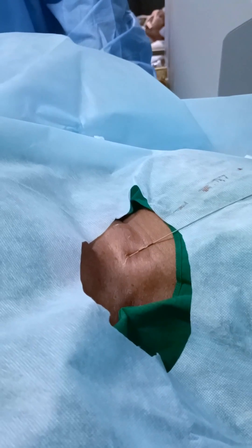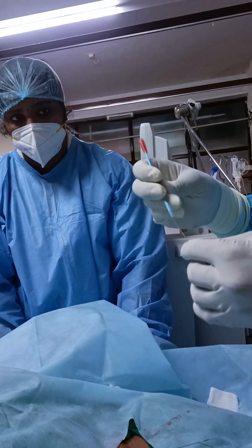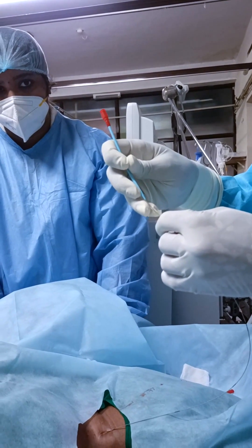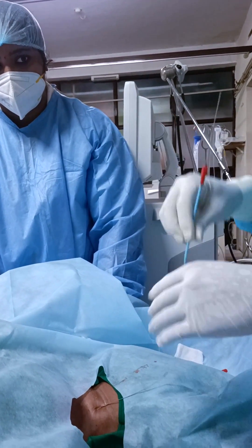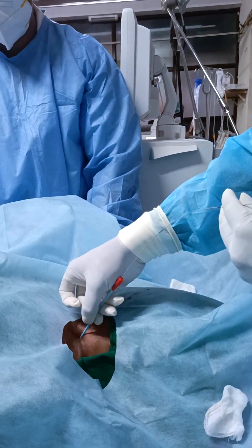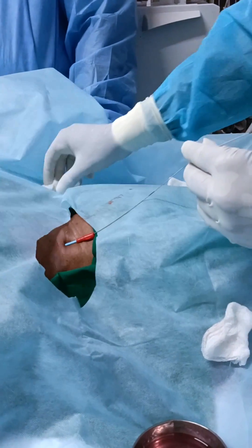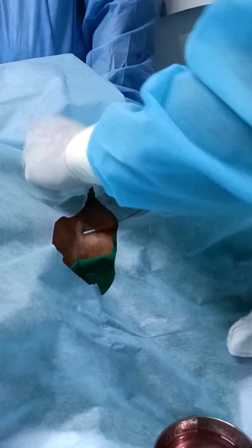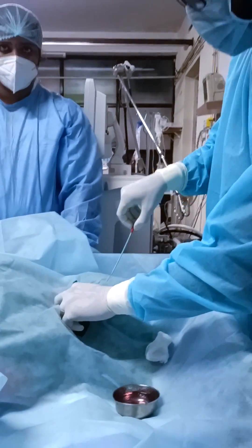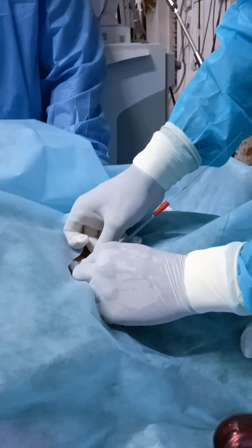Using a scalpel, make a little cut so that a dilator can pass in. First I am introducing a small dilator through the guide wire, and then inserting a bigger one.